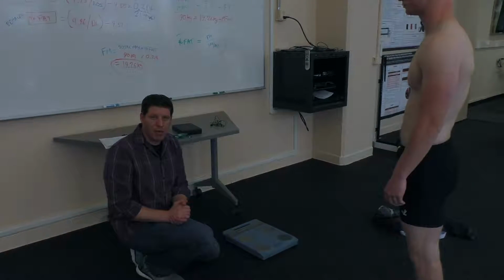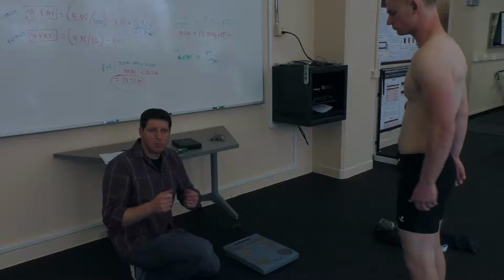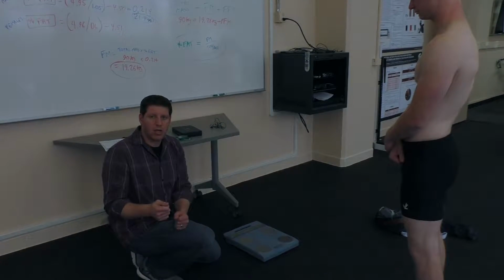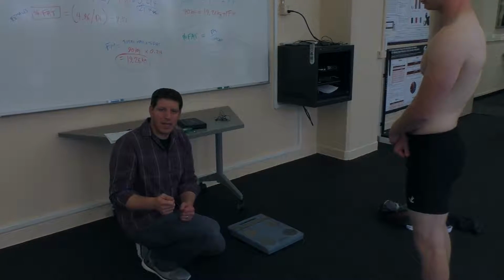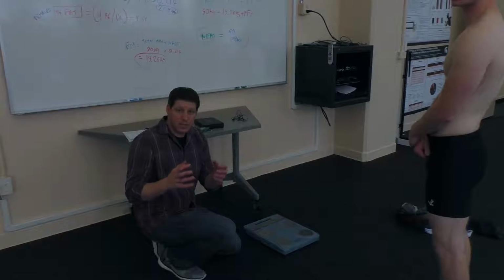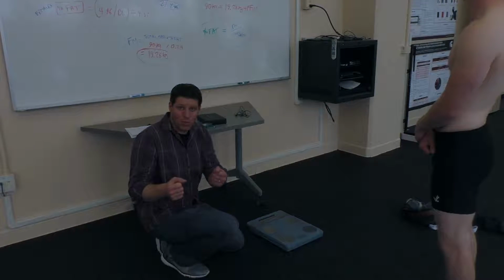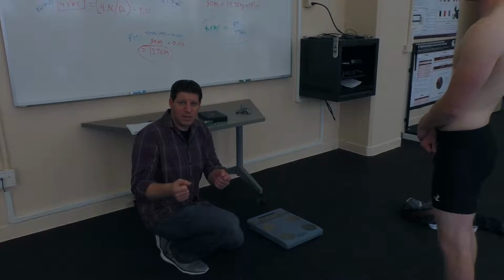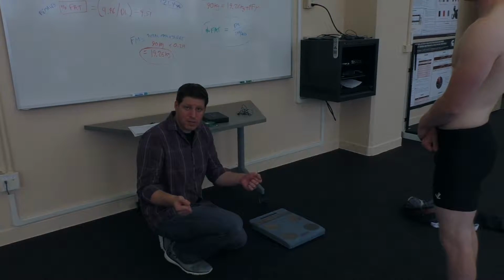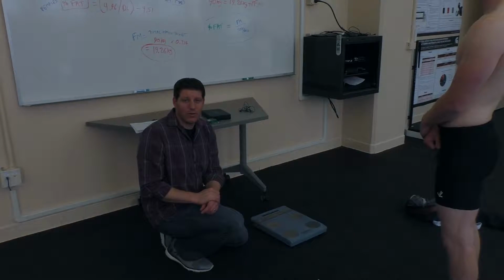But the whole principle behind bioelectrical impedance analysis is that a small current is passed through the body, is conducted through the body, and the extent to which that current is impeded dictates essentially how much fat an individual has. Because the assumption here is that water, which is in muscle, will conduct this current, but that fat will impede this current. So the more the impedance, obviously, according to BIA, the higher the amount of fat.